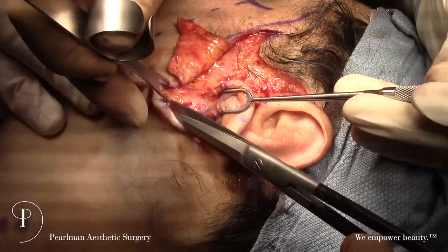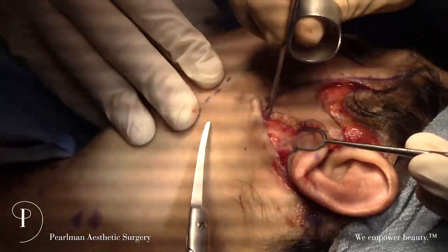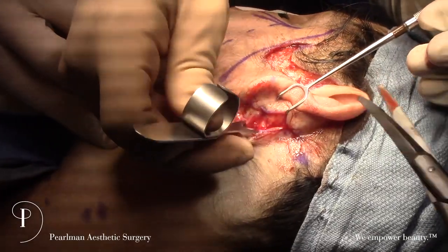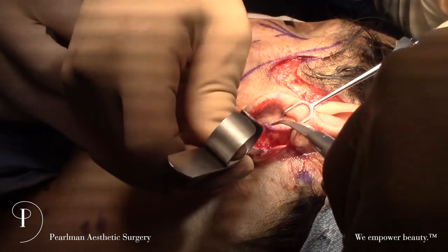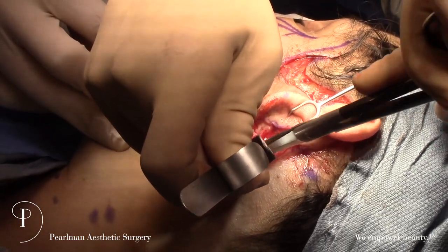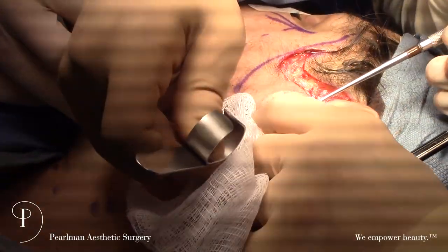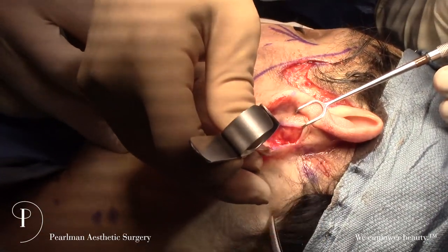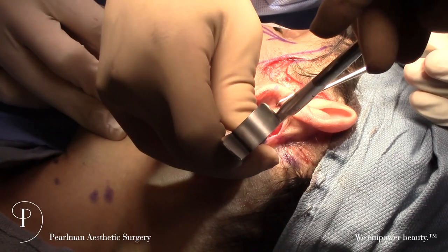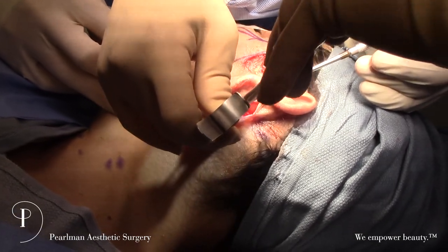We've now elevated around the ear and are starting to elevate down to meet the skin flap. I want to come up just short of the angle of the jawbone, which is right here — that's how far you want to lift this skin flap. It's trickier than coming down around the hairline, but for a young patient it's worth making a shorter incision. No incision back here always heals better than one that almost always looks good. Some people call this a ponytail incision.